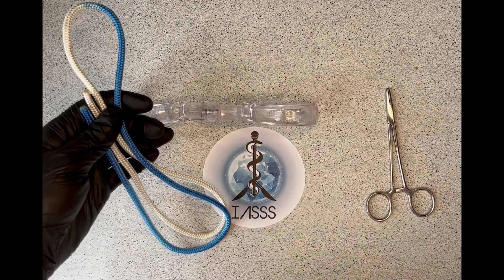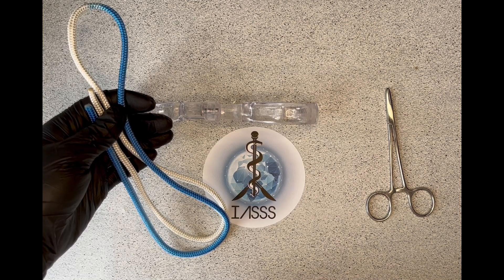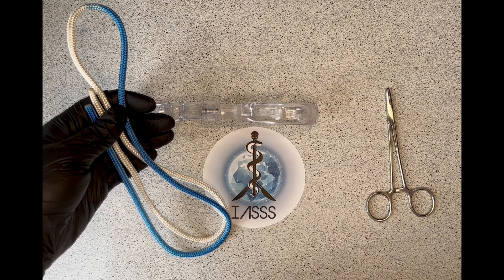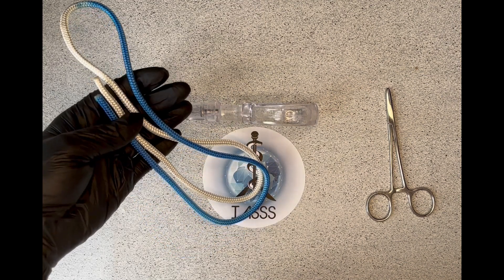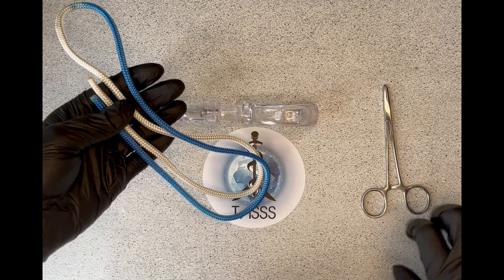Hi everyone, I'm going to show you how to do a hand tie to form a reef knot, a slip knot and a surgeon's knot. I'm going to start with using this rope and then I'll progress onto an instrument tie using sutures.